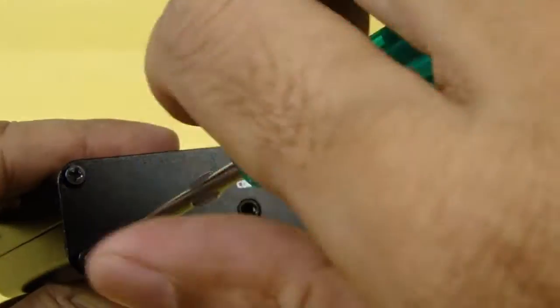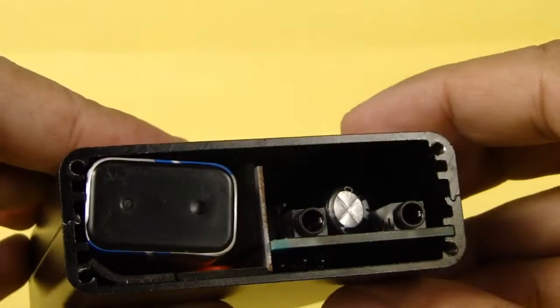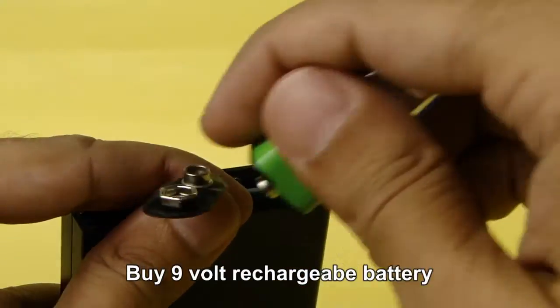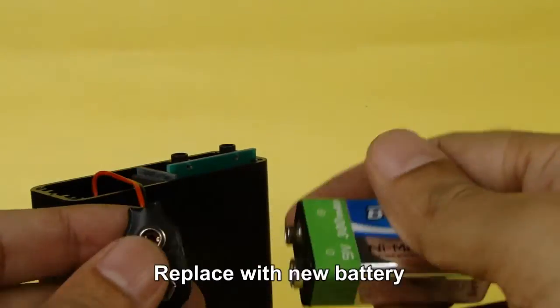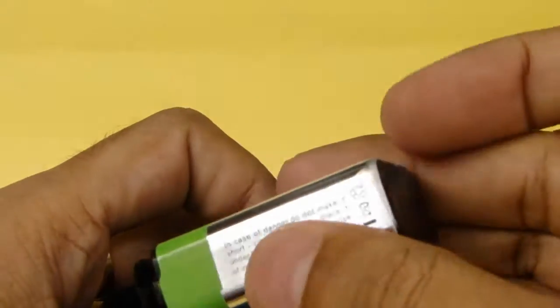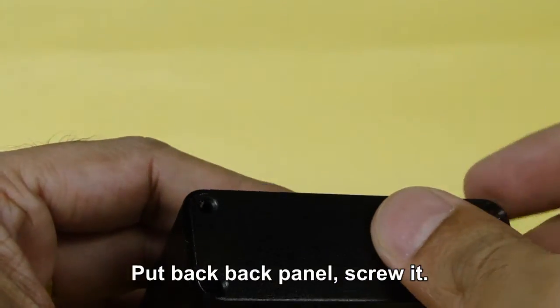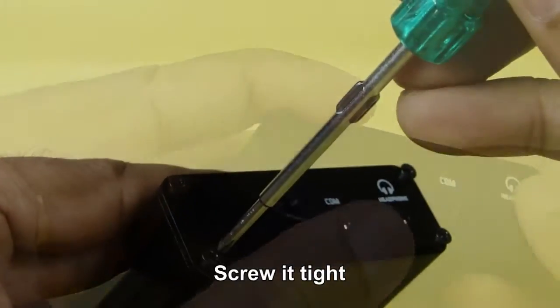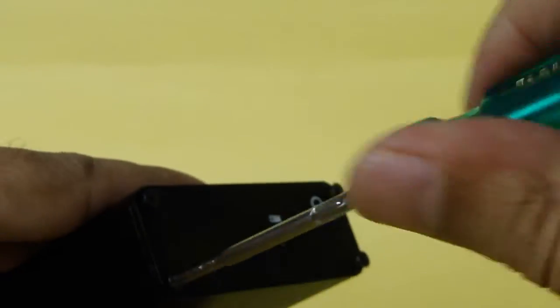If the red light is still not glowing, unscrew the back panel with the help of the screwdriver provided. Buy a 9 volt rechargeable battery and carefully replace the existing 9 volt rechargeable battery. Place back the back panel and screw it tight. Otherwise it may produce a hissing sound.